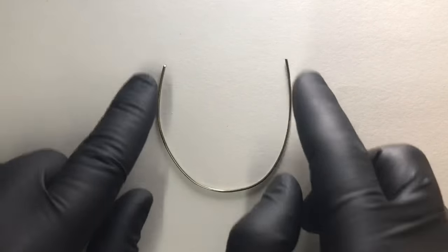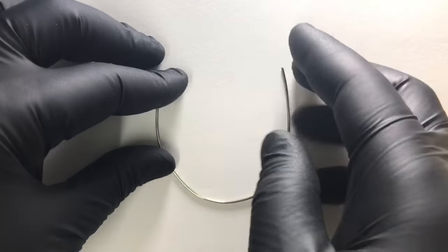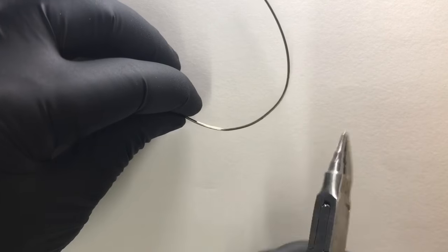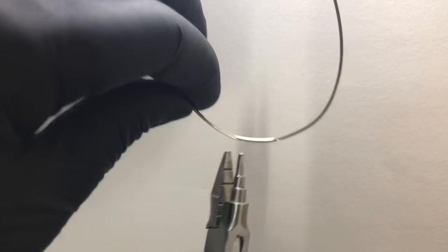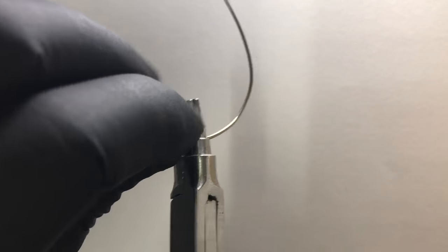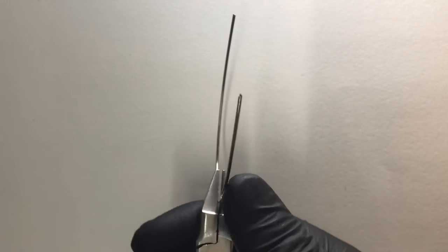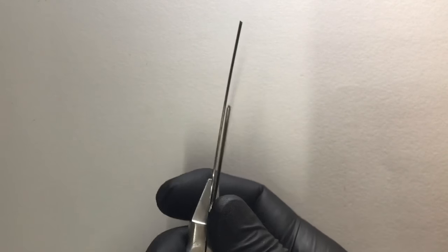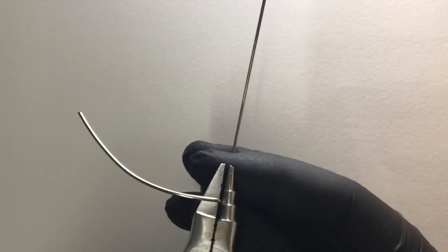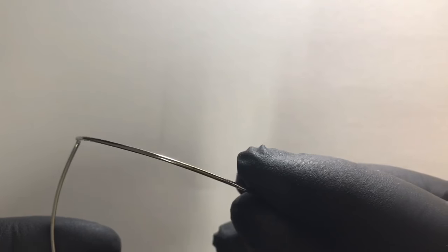Now let us begin with the bending part. Remember we should not distort the plane of the wire at any moment. First we will form the U-loops. For that we need to give a downward 90-degree bend at the medial part of the canine where we have marked the first point, without distorting the plane. As you can see, at that point we have given a 90-degree bend.